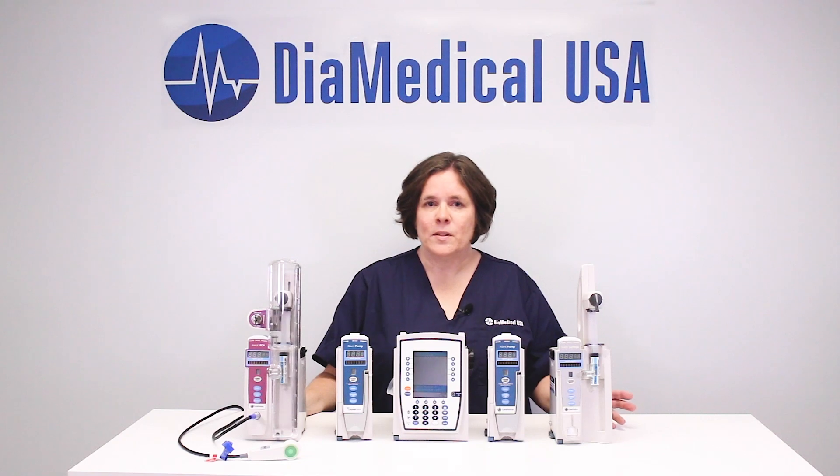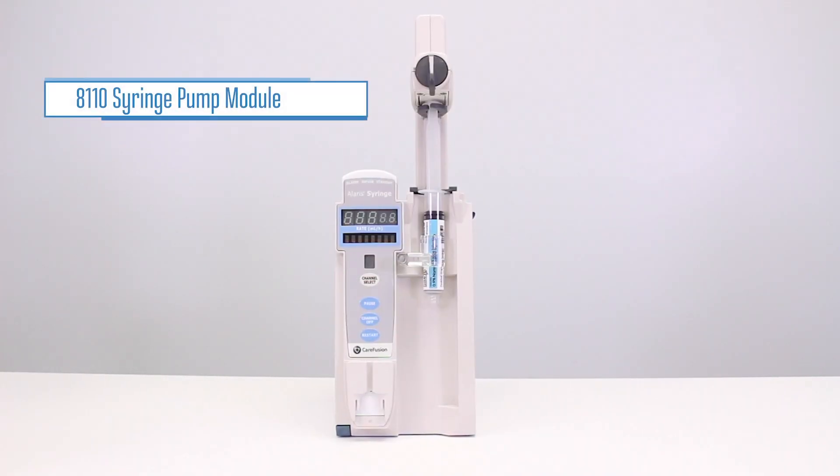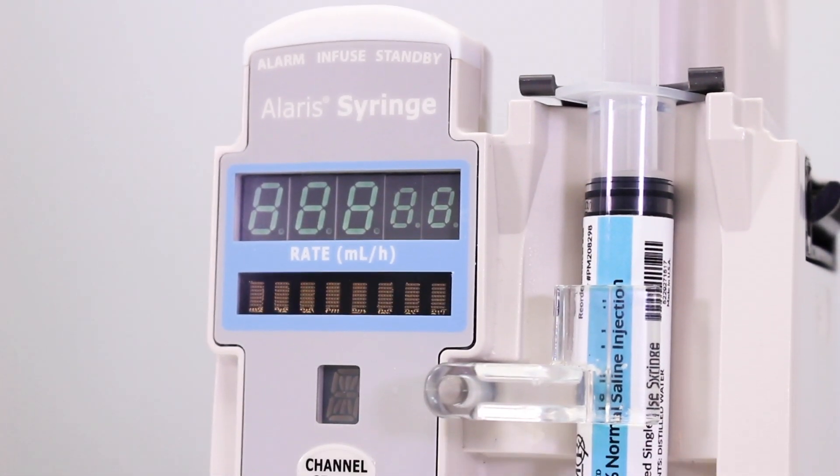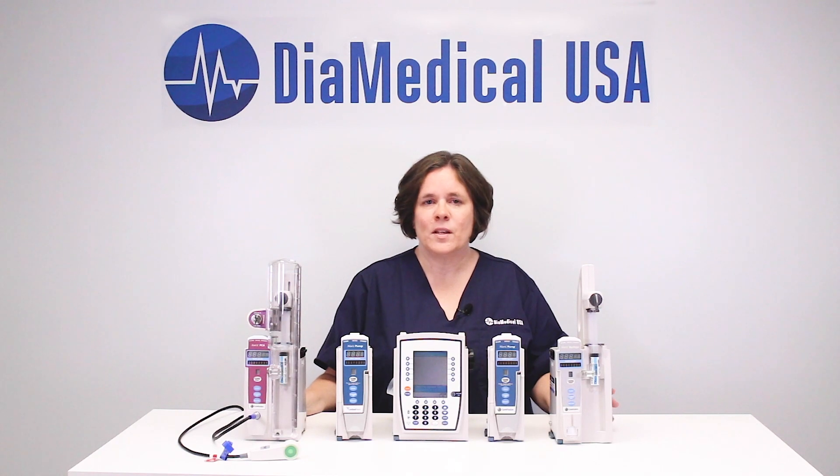The Alaris 8110 syringe pump module is used to administer very small amounts of medications from a syringe rather than an IV bag. It is ideal for pediatrics and anesthesia because dosage and infusion rates are extremely precise.